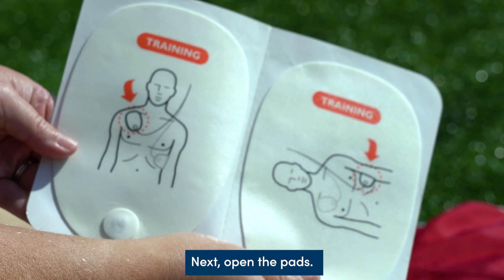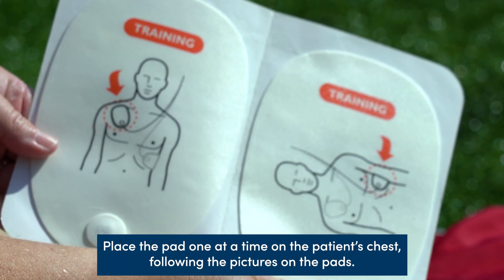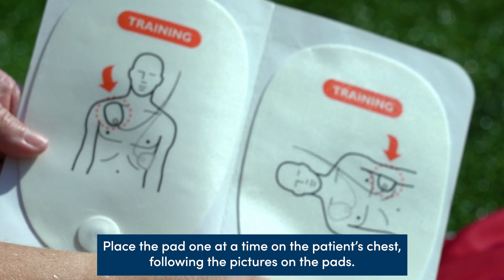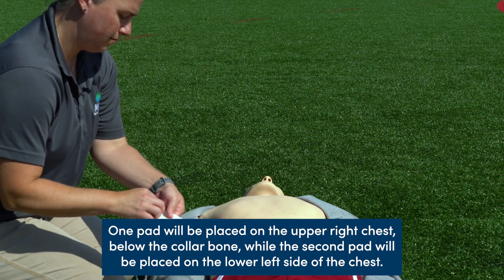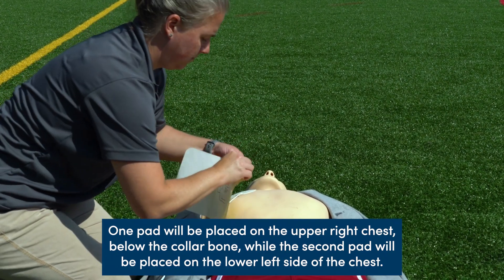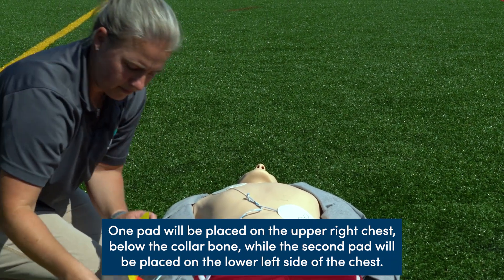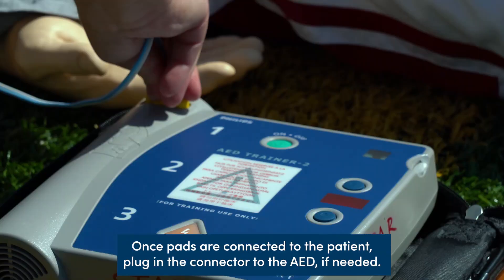Next, open the pads and place them one at a time on the patient's chest, following the pictures on the pads. One pad will be placed on the upper right chest, below the collarbone, while the second pad will be placed on the lower left side of the chest. Once the pads are connected to the patient, plug in the connector to the AED if needed.